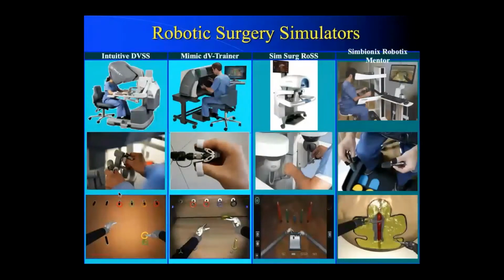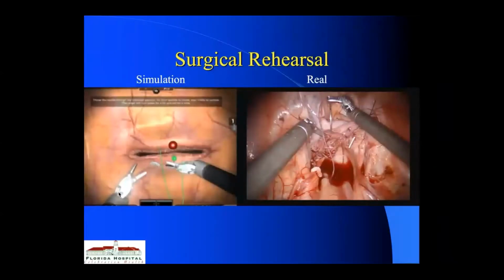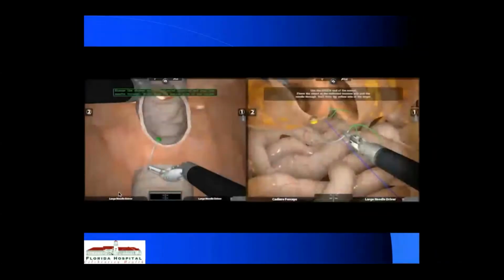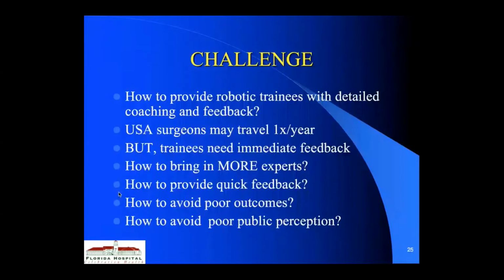And eventually, I bet it's going to be something that surgeons are even going to be able to do from their home. We want to match the surgical skill with the procedure. Here, in the case of another hysterectomy in a pig, you can see how they do the simulator, and then we can do it in the lab. And these simulators are going to continue to get better. The thing is, how can we extrapolate these training programs to the trainees, and how are we going to coach it? Feedback is going to be virtual, in person. However, I think a lot of these simulators are going to continue to improve since you won't have to travel to a training point, but actually can do it in your own backyard, essentially, and then watch people virtually.